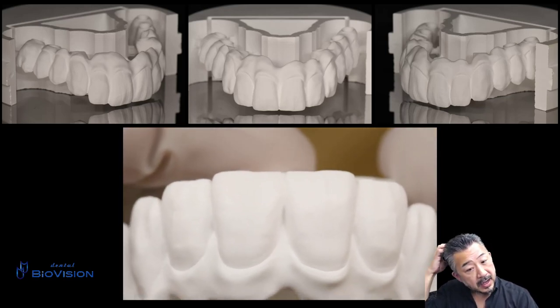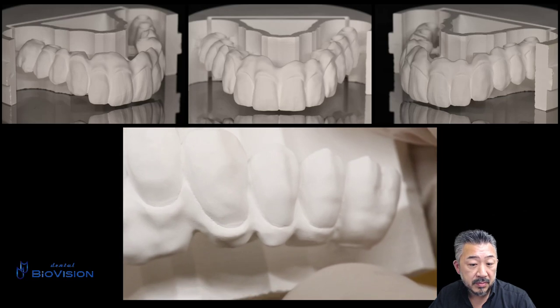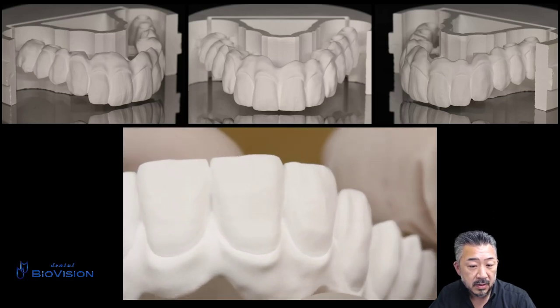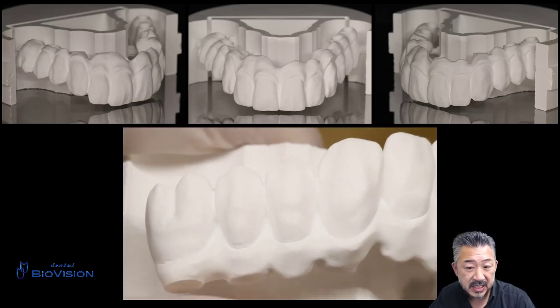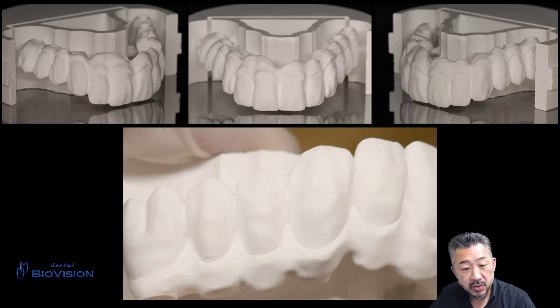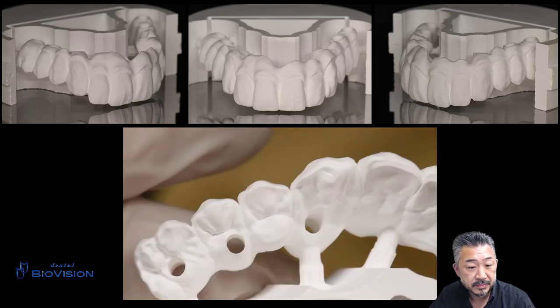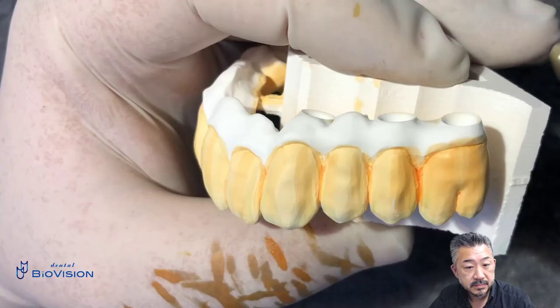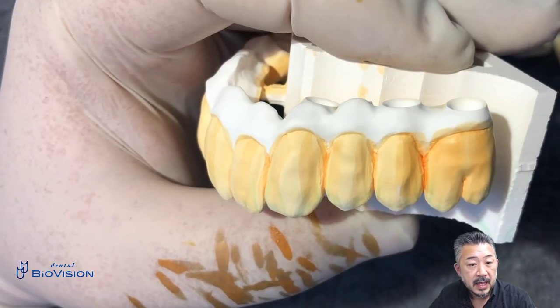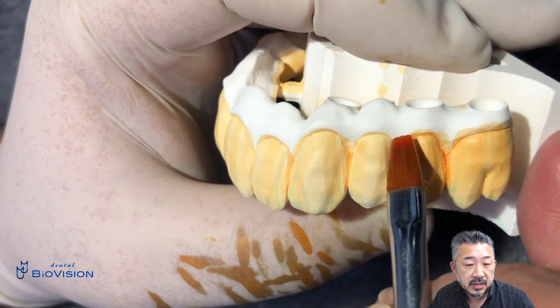Using a diamond disc on the zirconia frame after milling, only a little cut is made in the interdental part and almost no shape correction is performed. I will color the zirconia with the sintering liquid.